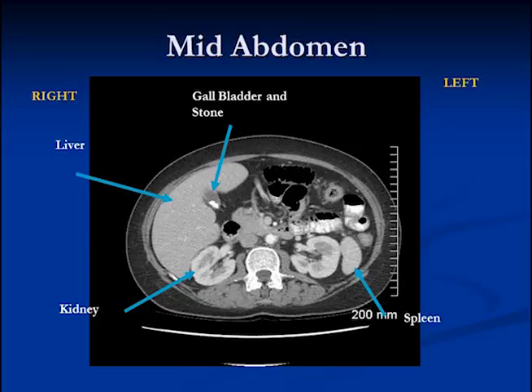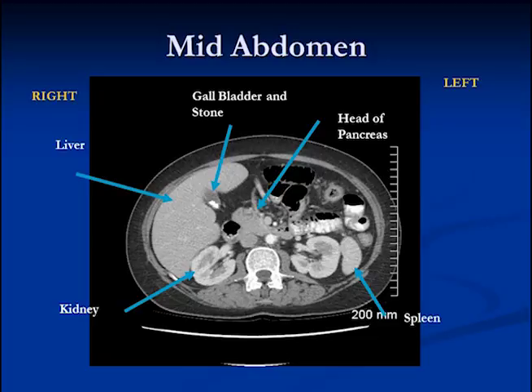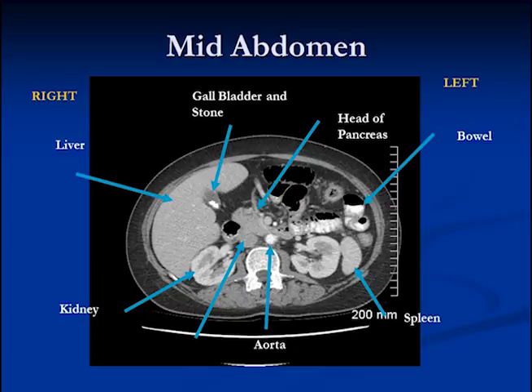The black part is the gallbladder with the bile, and the very white part is the stone. We have the head of the pancreas just to the right of the midline. Again we have the aorta, and right next to it we have the inferior vena cava, and here we have contrast-containing loops of small bowel, as you can see.